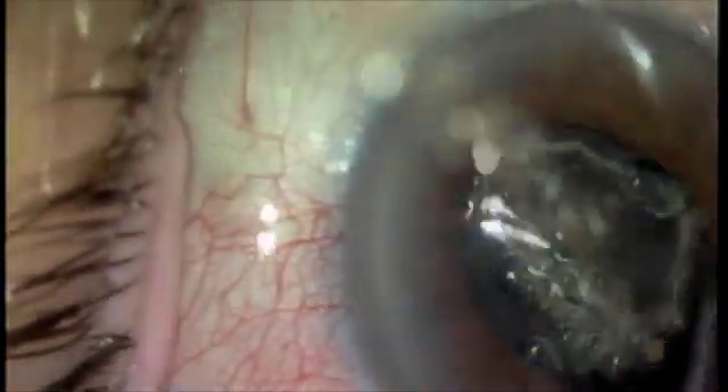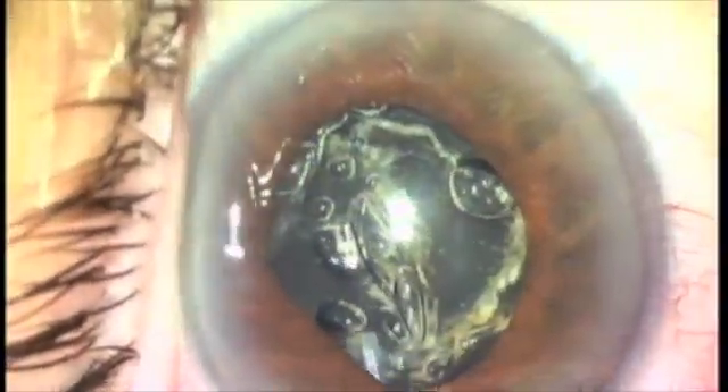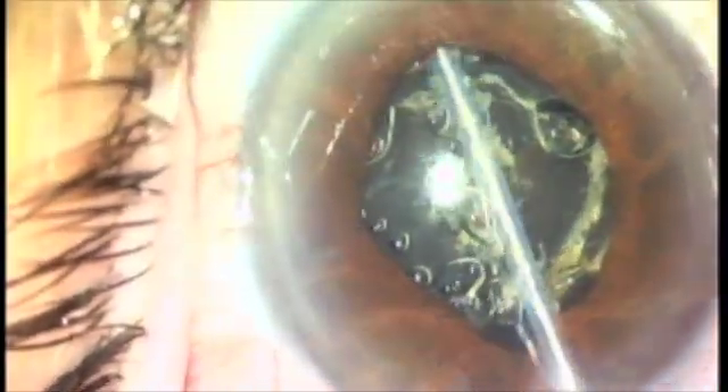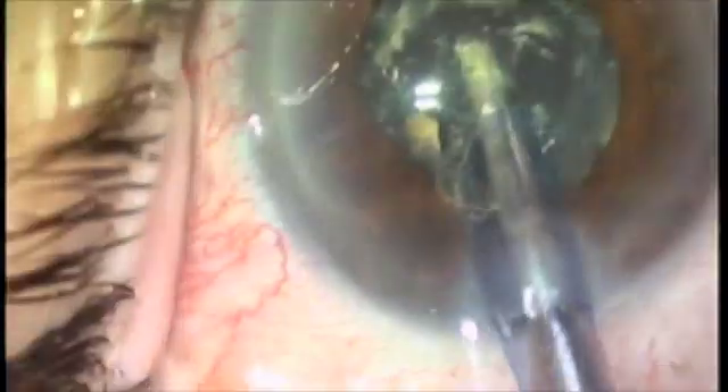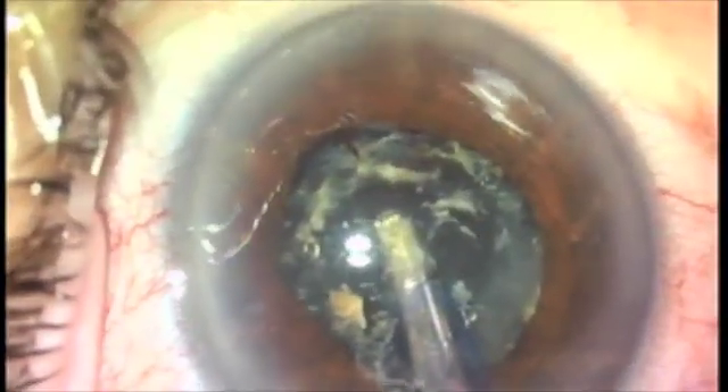I've stretched the pupil, which you normally don't do. You can get away with this when you have plasma ablation. I lift up the iris with a little viscoelastic, and now I'm going under the iris out of surgeon view and making a large capsulotomy.